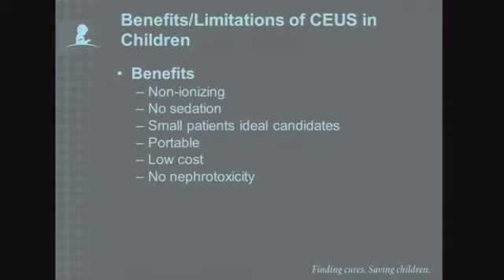So, the benefits of contrast-enhanced ultrasound, especially in children, are that it's a non-ionizing modality. And this is especially important in our pediatric population. Also, no sedation is required to perform ultrasound, as is often necessary for MR examinations and sometimes even for CT. Small patients in general are excellent candidates for ultrasound and therefore also ideal candidates for the application of contrast agents in ultrasound to optimize ultrasound imaging.